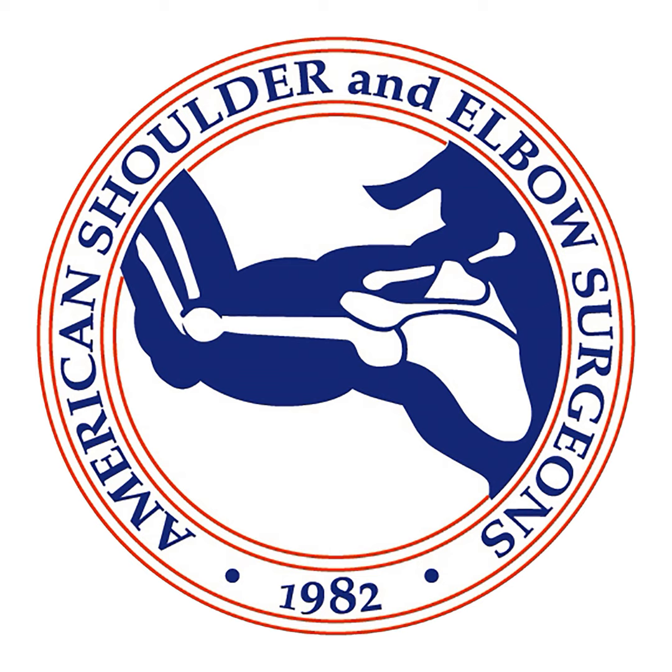What are your thoughts, Dr. Wiater? Anything to add? Well, it's certainly tried and true, and it's familiar to literally every surgeon. So that really goes a long way. It works in any situation, just about, except for a severe malunion of the proximal humerus. So straightforward primary cases do well with stemmed implants, up to the most complicated revisions. So it's a very effective technique, and it has certainly withstood the test of time.